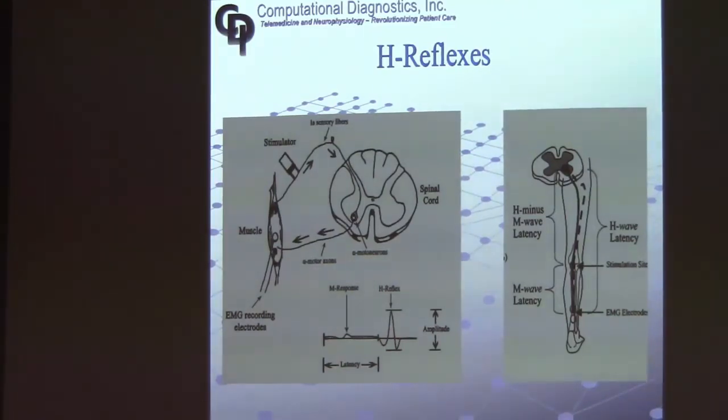We don't use a lot of H reflexes. Once in a great while we'll do them. I know some people use them a lot. I personally haven't felt a lot of value in them.